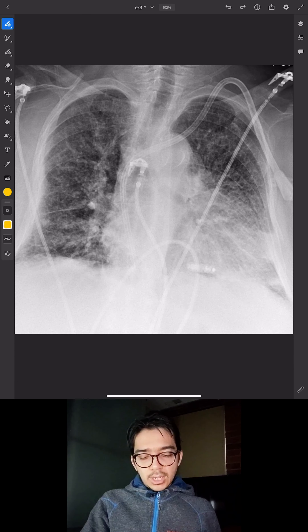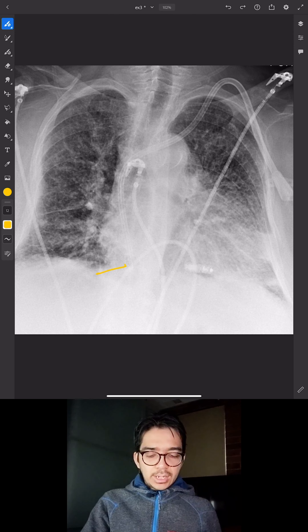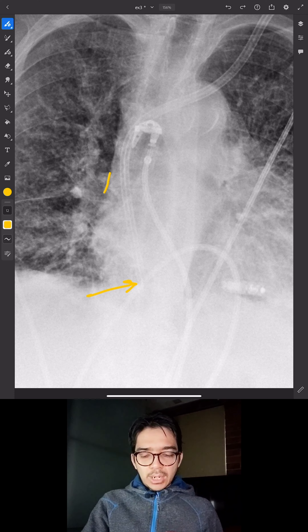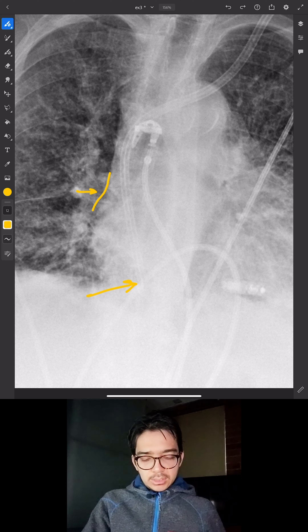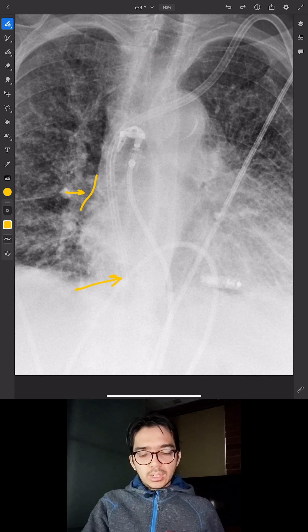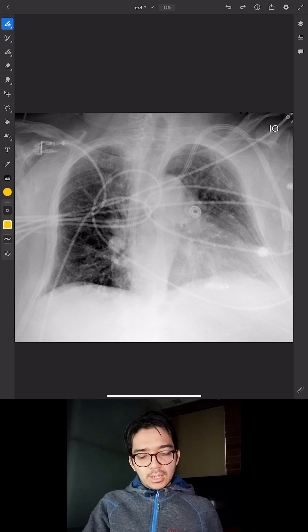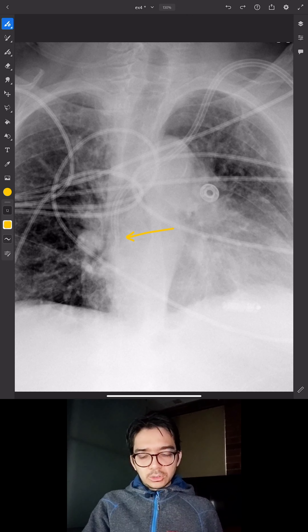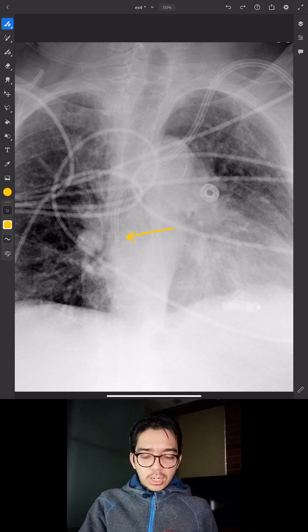Here's a left IJ central line where the catheter tip is deep. Using our landmarks, the superior cavoatrial junction is approximately here, and the tip is deep into the right atrium — actually in the lower part of the right atrium. These are not ideal because there's a higher chance of arrhythmias if the catheter is positioned in the right atrium. After replacement, the tip is right at the superior cavoatrial junction — good position.